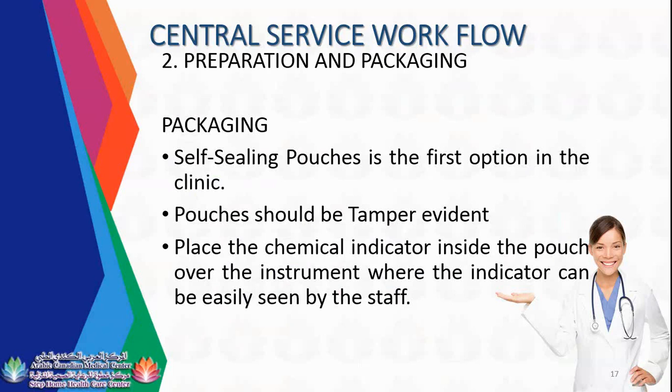Self-sealing pouches are the first option in the clinic. In the hospital, they use linens, the green linens, or the muslin wrap. Pouches should be tamper-evident. Tamper-evident means that once you open the pouch, you can detect that it was opened, because the edges of the pouch will not return to the same usual sealing.